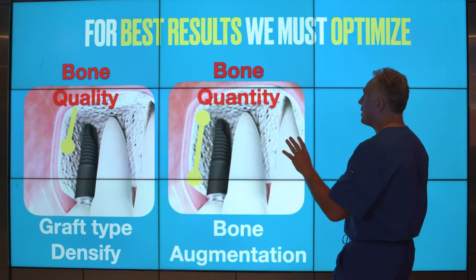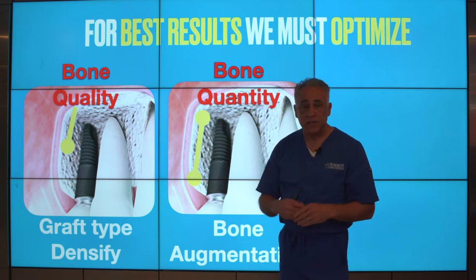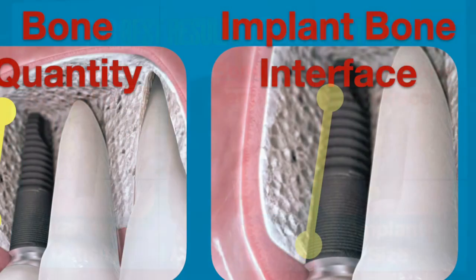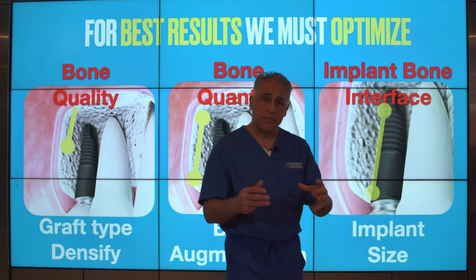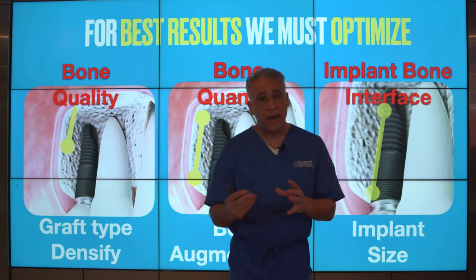The second factor that's really important to address is the quantity of bone. Just how much of it do we have? And of course, we can affect this by bone augmentation, the sinus lift procedure being the technique of choice in this circumstance. And the third is the implant to bone interface. This is essentially the contact between the implant surface and the bone, which we need to maximize as much as possible. And this is directly related to the implant size, both its diameter as well as its length.